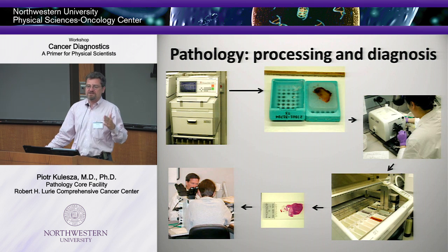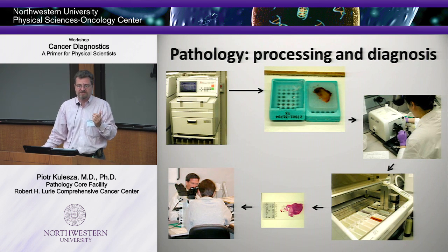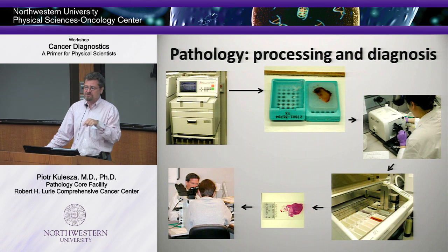So these sections of the specimen, now you can have a case with 20 slides, you can have a case on occasion with 86 slides, or 1 slide if it's a small piece of tissue. But this is what we look at to make the diagnosis.